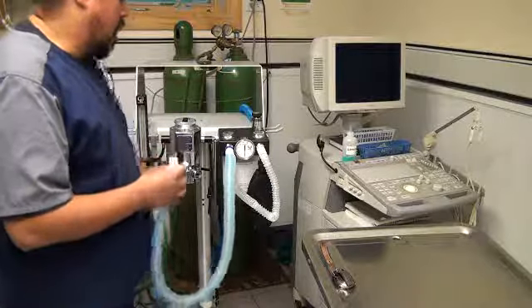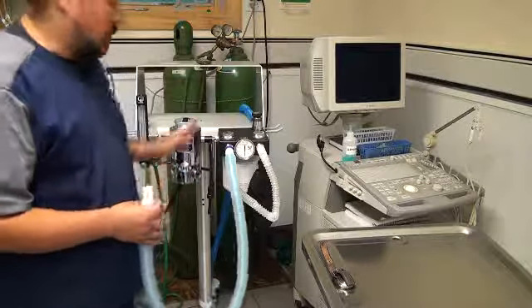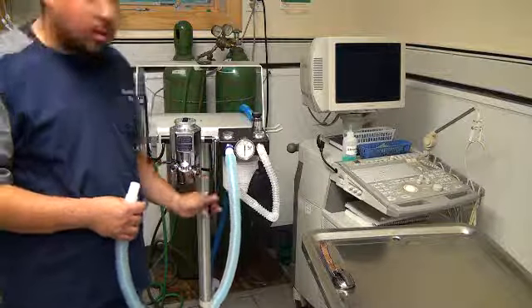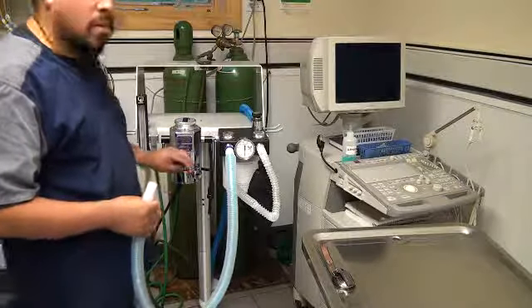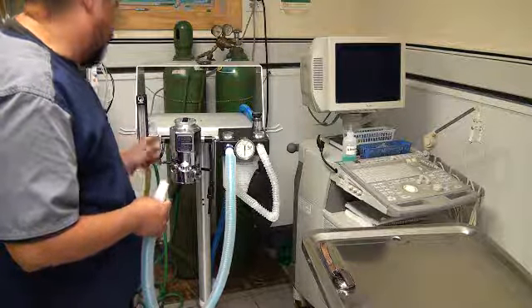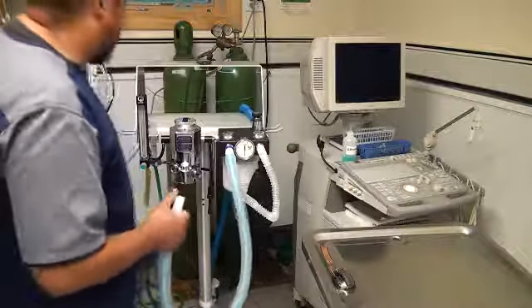You should do this check anytime before you do an anesthetic procedure involving anesthesia. Anytime any pieces of equipment are replaced, tubing, filling up the isoflurane with more fluid. Anytime anything is done, you should check it. All these are points of failure for the machine.